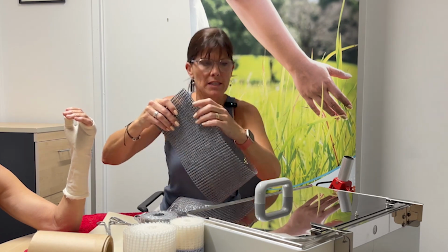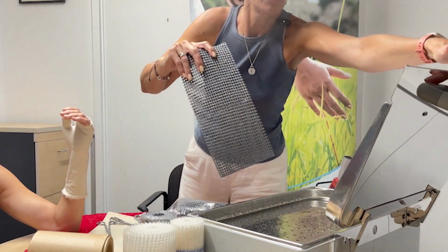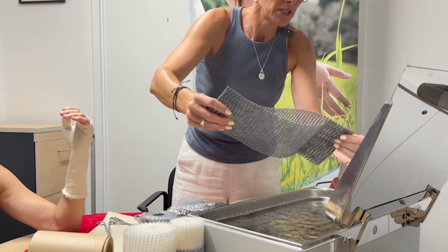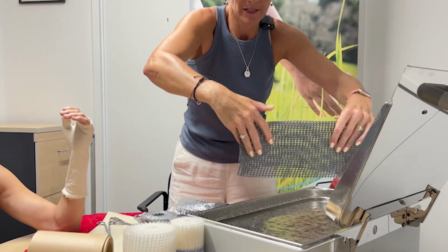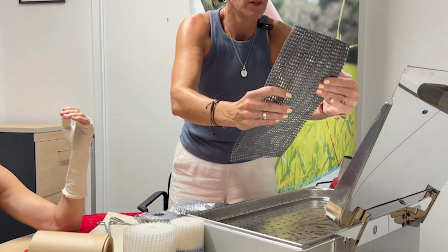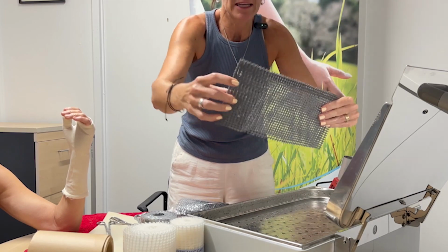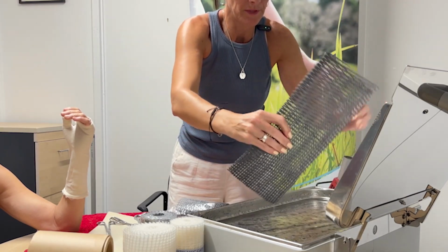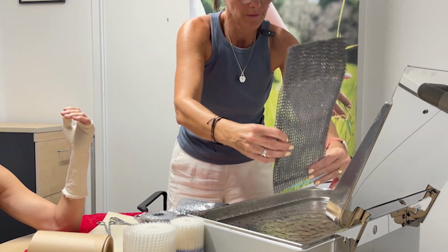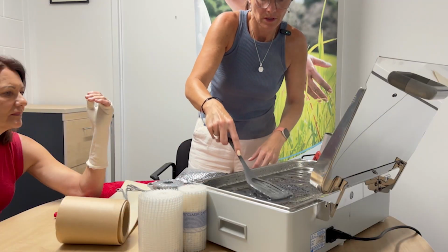I'm going to put those two pieces together into the splint pan. So your water bath is going to be at 70 degrees. And you're just really wanting to squeeze the edges together. Now the neat thing that I've learned about X-Lite is that the heat is actually the water. The heat is not the material itself. The material doesn't get really hot when you're molding it. I'm just going to squeeze those edges together. And then I'm going to pop that in there for a minute or so.